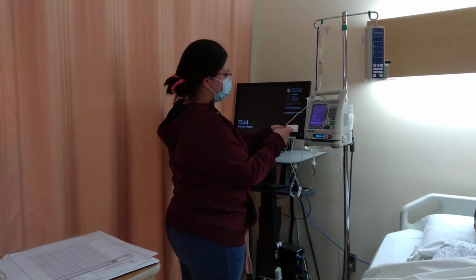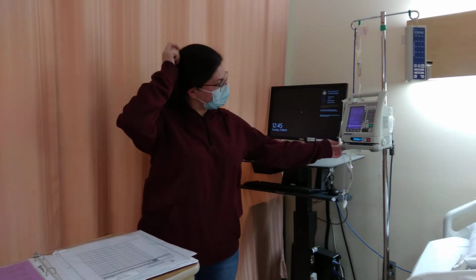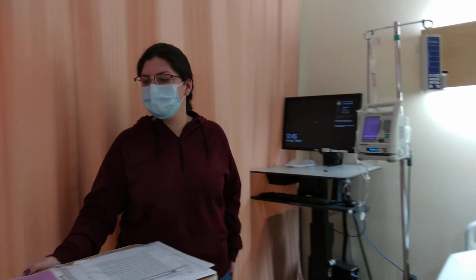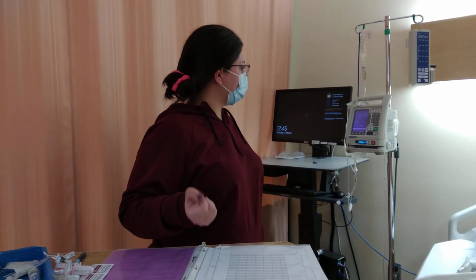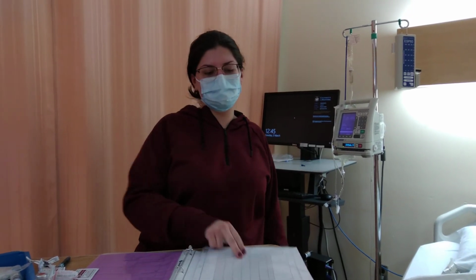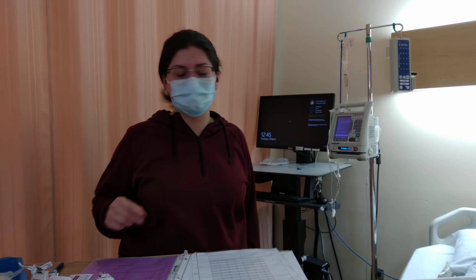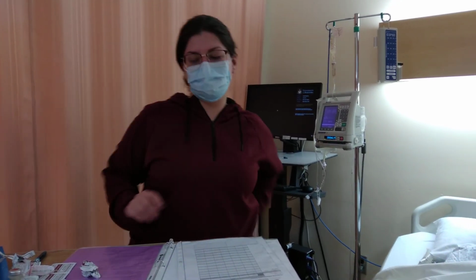So right now I can go ahead and administer my medication. We wrote the date and the time. After my primary, we would have checked that the primary rate is running at the rate that the MAR states, the correct rate. That should be everything.